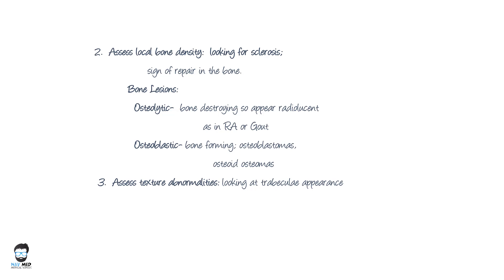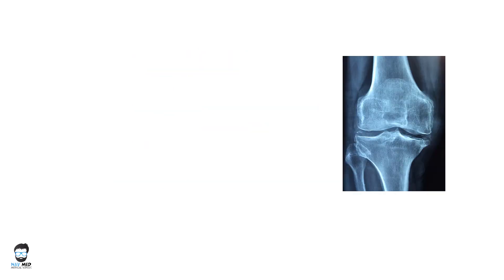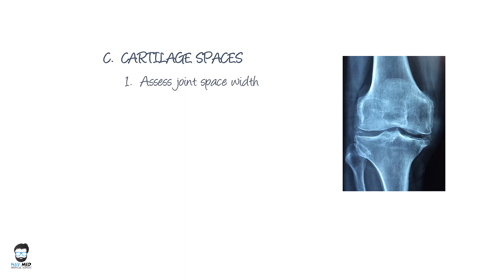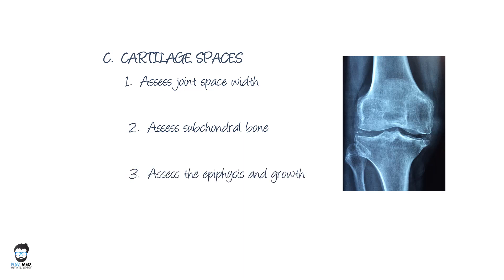You should also assess texture abnormalities by looking at the trabeculae, especially in femoral neck fractures. For C — cartilage — as shown in an image of a knee with arthritis, you assess the joint space width and the subchondral bone for cysts and other changes. Also assess the epiphysis, especially in children.